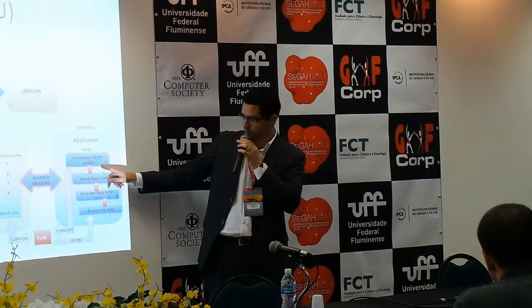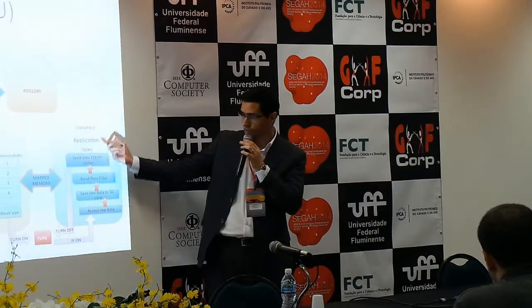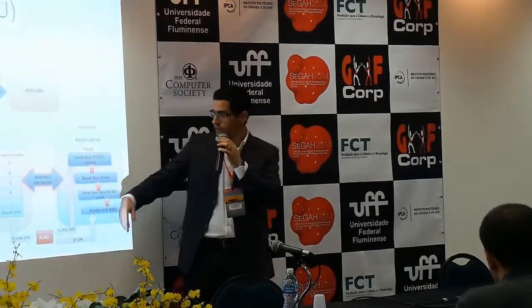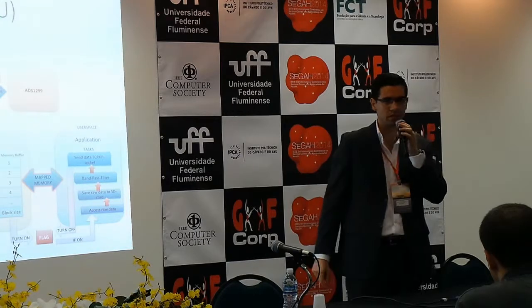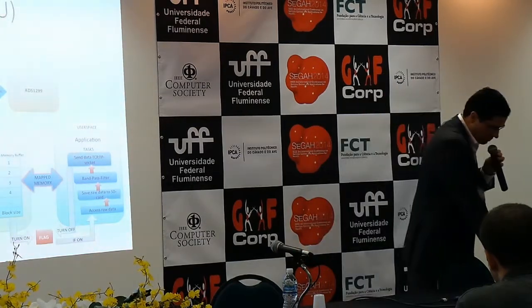Then you send data wirelessly to other devices. This is the user space, that's the kernel space. Once this is finished, the flag goes back off, and the cycle of the data packet is complete.